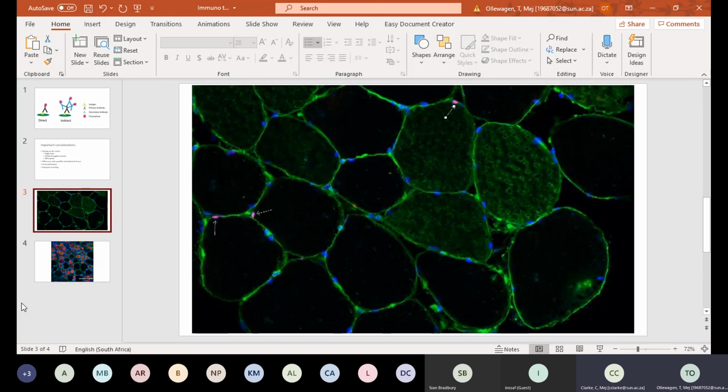But try not to leave them in the freezer for too long if you've got a very sensitive protein. We do get a lot of autofluorescence, which Lisa will discuss in her talk, and I'm sure the recordings will become available. But these things you can compensate for on the microscope and on the settings, and that's why we use the controls that we use. The 488, the green, is one of the antibodies that does bring up a lot of autofluorescence. So it's just another thing to take into consideration.